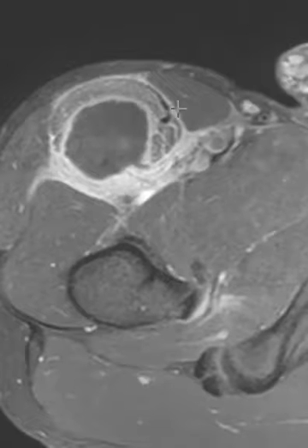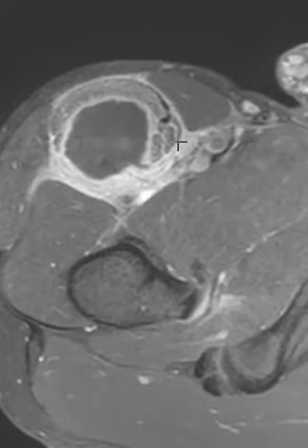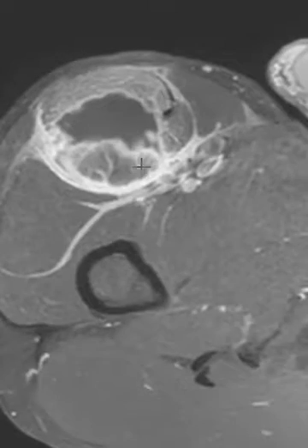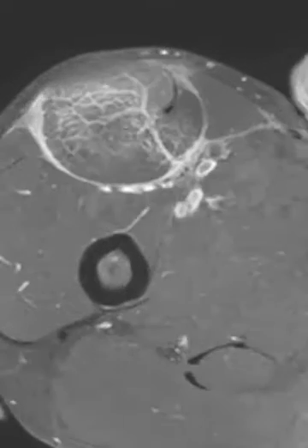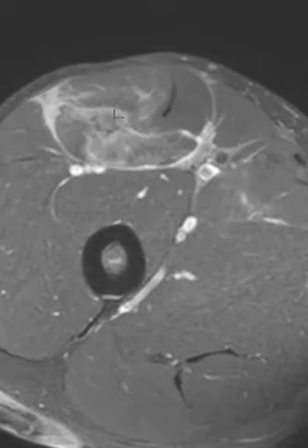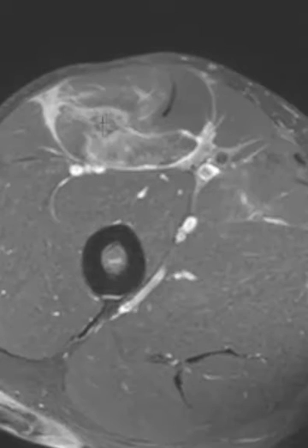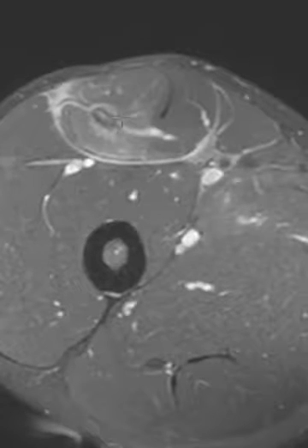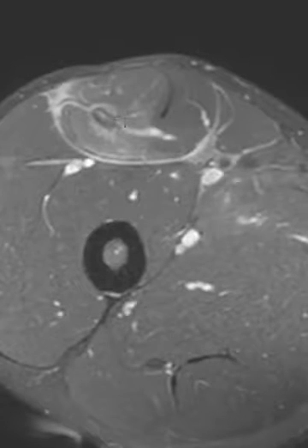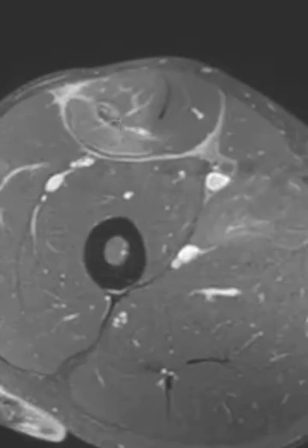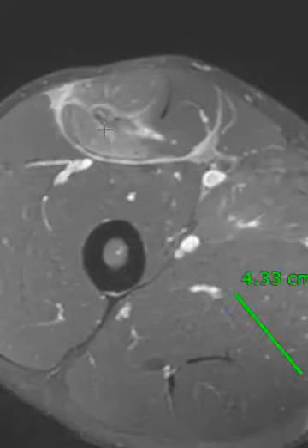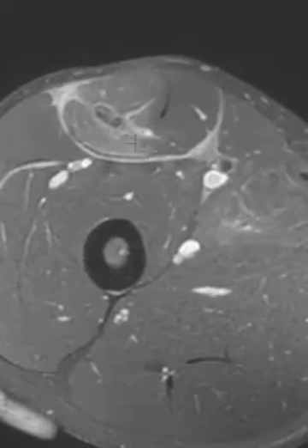Up here we can see this well-defined fluid collection — a hematoma. This is the direct head around the periphery; some of the fiber is still intact. The more central part of the muscle is torn. Coming down, we get into the indirect head. You can see how that indirect tendon is retracted distally because of the muscle tear, and there's a little muscle strain surrounding the central tendon there.